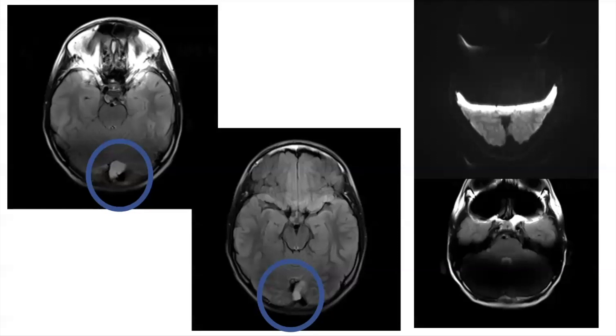The other thing - this is a recent case. This was a patient with headaches and you notice there's this space behind the cerebellum that is very high signal intensity on the FLAIR scan. You see complete suppression of CSF here in the interpeduncular cistern and along the sylvian fissures and cortical sulci. That should lead you to think this is not CSF because it's not suppressing like CSF elsewhere. One possibility you should consider in the posterior fossa would be an epidermoid. We go to the diffusion scan and it doesn't have restricted diffusion, but now you notice these giant artifacts. These are artifacts from braces. This became an indeterminate finding.